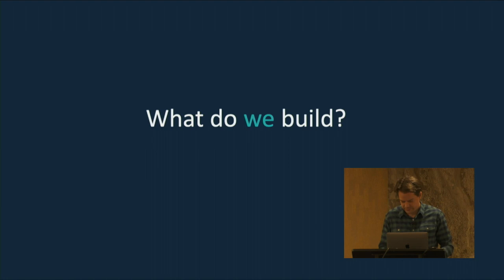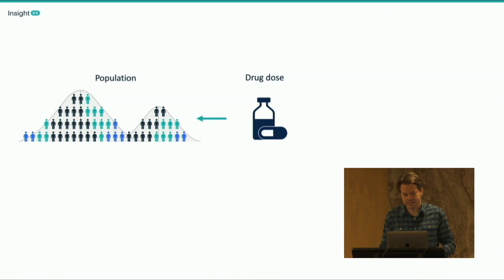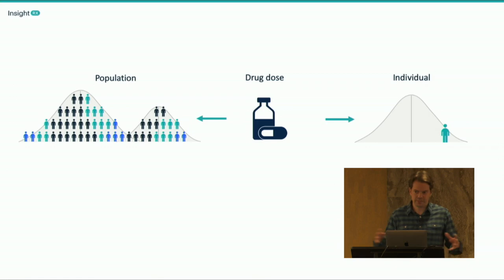But to go into what we are actually building, let's say, and let's hope it won't happen, you have to go into the hospital for maybe an infection or something. You will get a dose of a drug, but you have to realize that dose is often developed based on the average of a population, and it might not actually be the best dose for you as an individual, because you might be on one of the extremes of that in terms of the pharmacology.